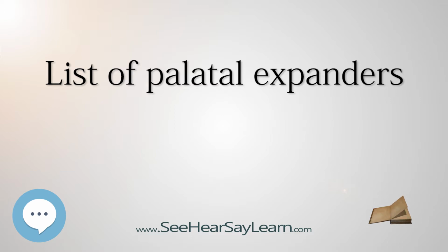Tooth-borne vs. bone-borne expansion. A study published by Lin et al. in 2015 found that for patients in late adolescence, bone-borne expanders produced greater orthopedic effects and fewer dentoalveolar side effects compared to the Hyrax expanders.